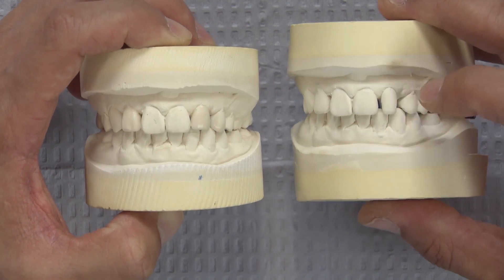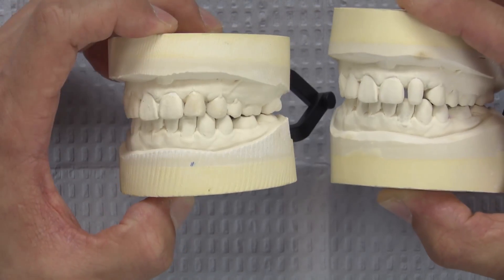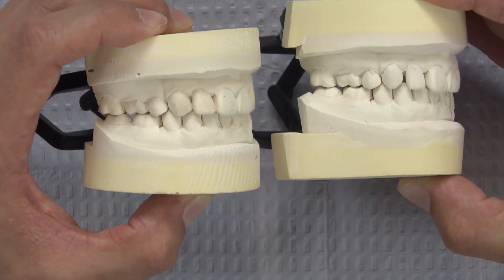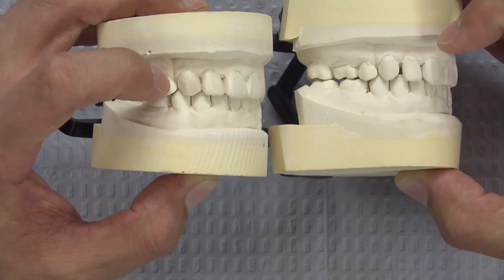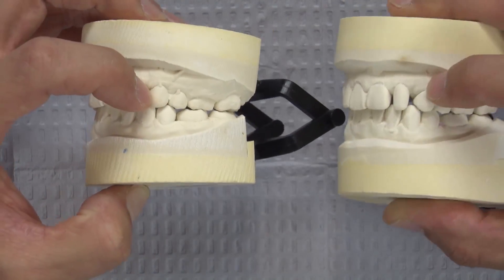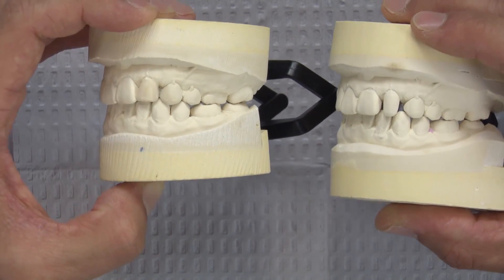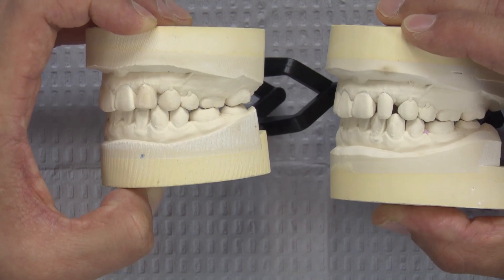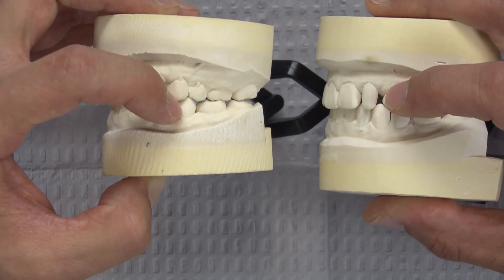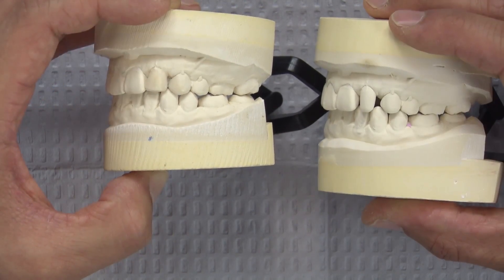I did apply wax to the mesial and distal surfaces of both 7 and 10. But to avoid the laterals from appearing too wide, I did apply wax to the mesial portions of the canines — number 6. And since number 11 is missing, number 12 is occupying that space, so we're going to attempt to mimic a left canine by extending it. We lengthen it a little bit and bring that mesial surface over.